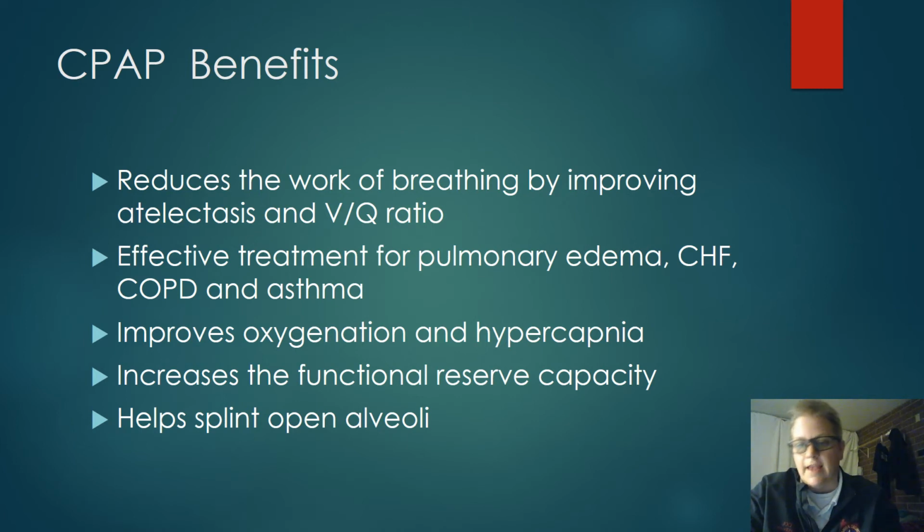So if they can't handle that, or if it's not seeming to help, you can dial both of those up a little bit or down a little bit to help them overcome the problems with that high pressure.